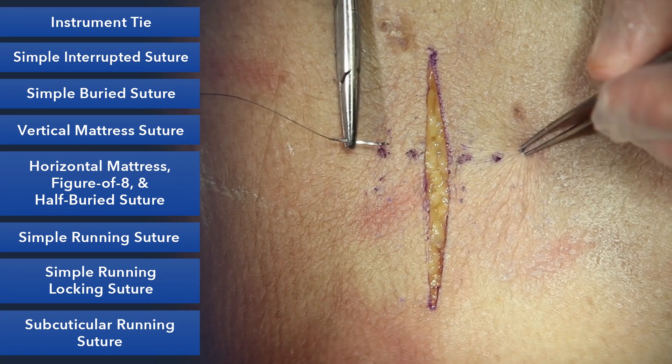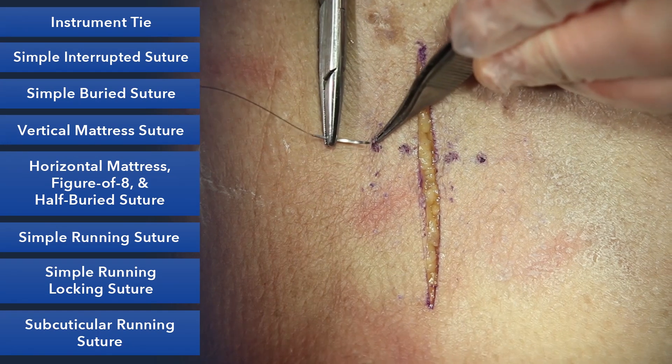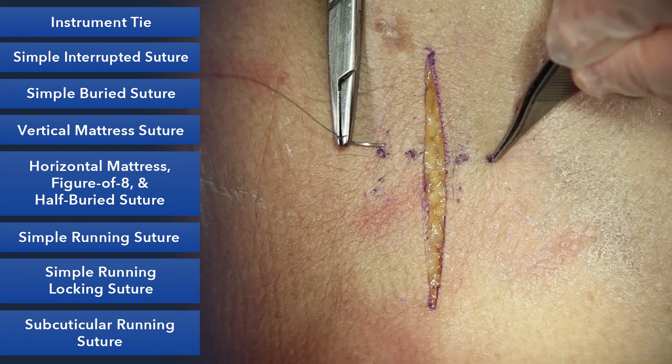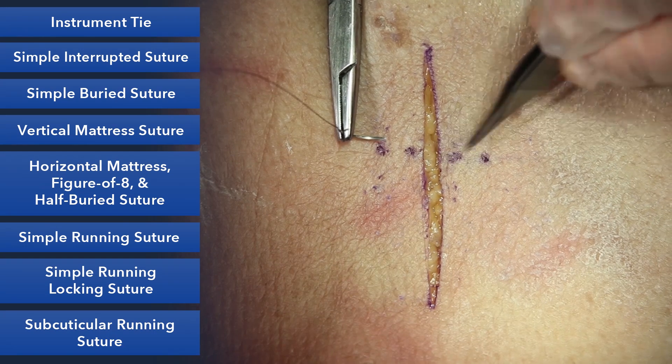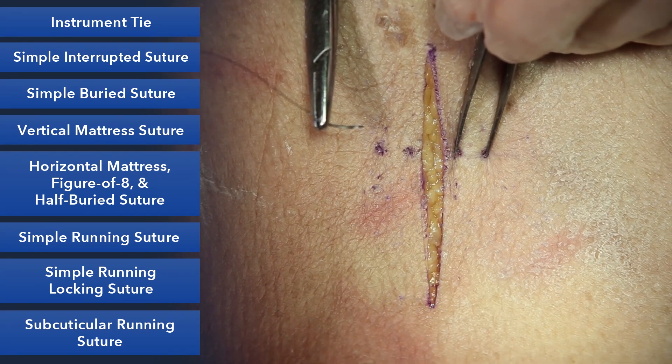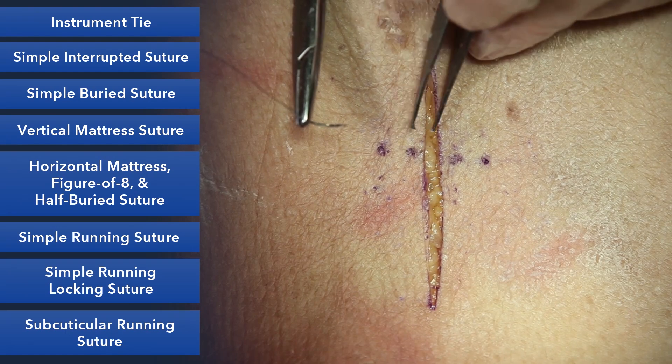Some will call this the far-far-near-near stitch, and this is the configuration of your suturing. We're going to enter far from the wound, travel under the skin, come out far, and then come back and go near-near. Essentially you're taking this part of the skin and closing it to this part of the skin, and that's the power of the suture.